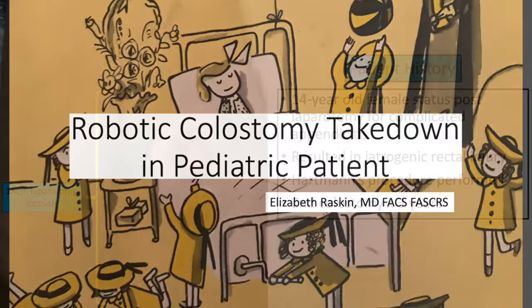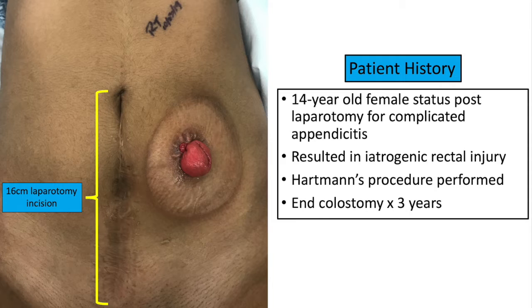This video shows a robotic colostomy takedown in a pediatric patient. Our patient is a 14-year-old female who has status post-laparotomy for complicated appendicitis, which resulted in an iatrogenic bowel injury. She had a subsequent Hartmann's procedure performed through a 16-centimeter long incision and has lived with an end colostomy for the past three years.